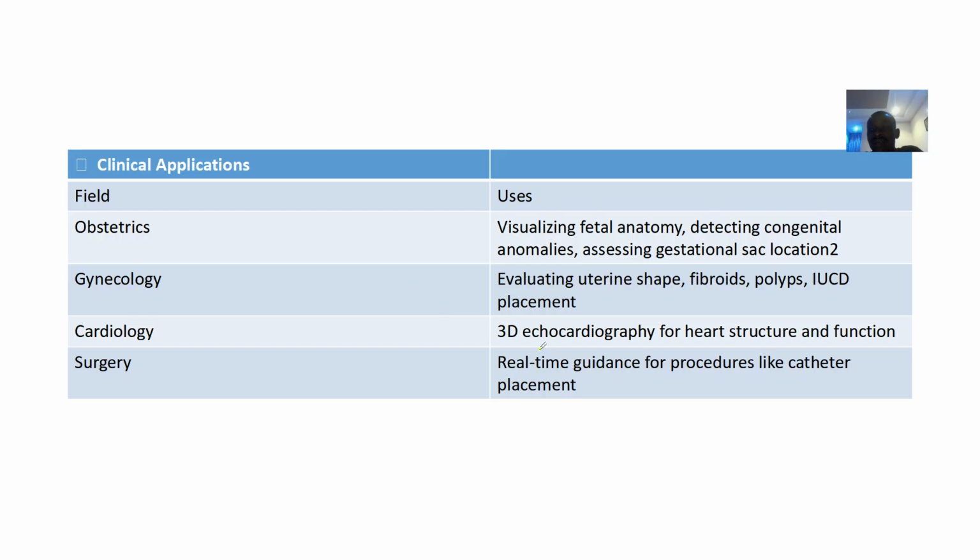Then also for the heart, I want to view if there's any issue with the structure or the function. Then it can also guide you. Let me say you want to do a procedure inside someone, such as taking some amniotic fluid. The ultrasound is guiding you so that you don't pinch the baby. So it can help with real-time guidance for surgical procedures.